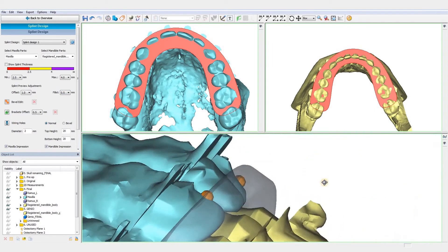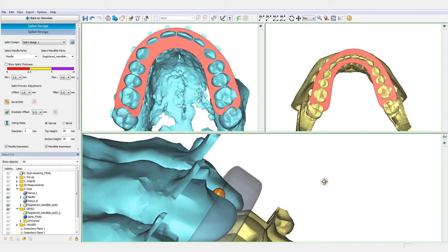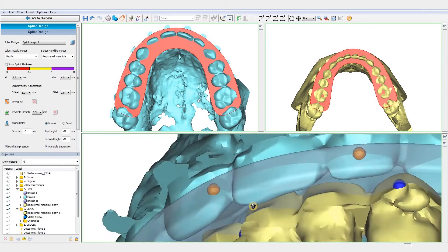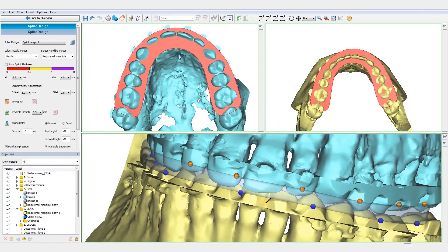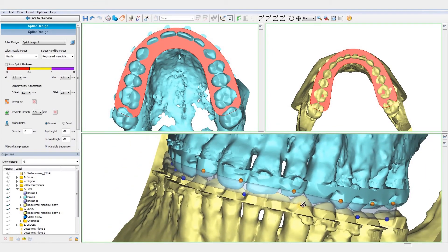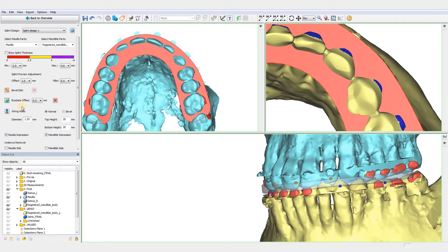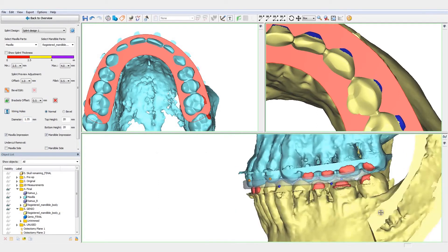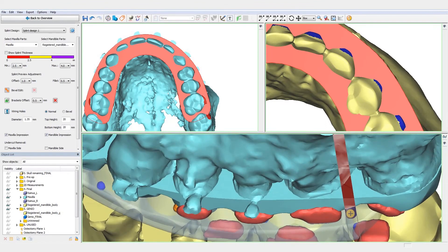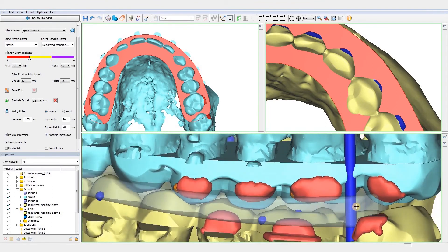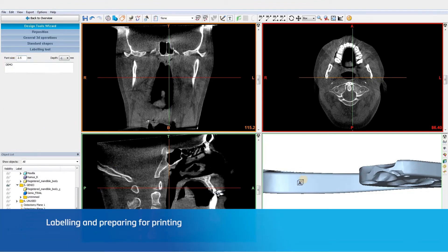Another option is the fillet option, to round the edges of the splint and remove any sharp edges. Placing wiring holes is also possible with this option. Once we are happy with our final splint design, we can label the splint with the patient ID for traceability.